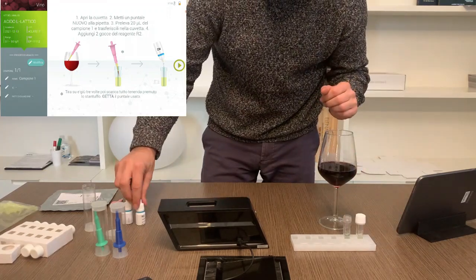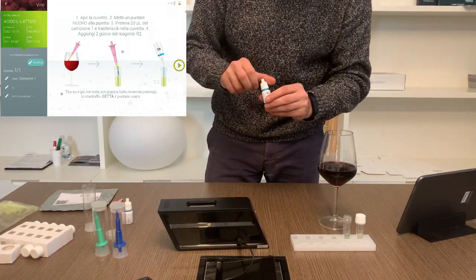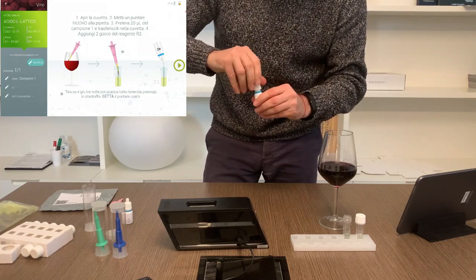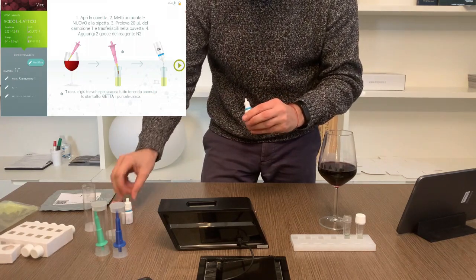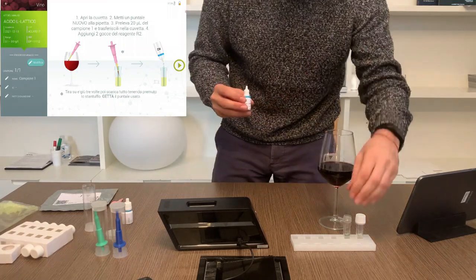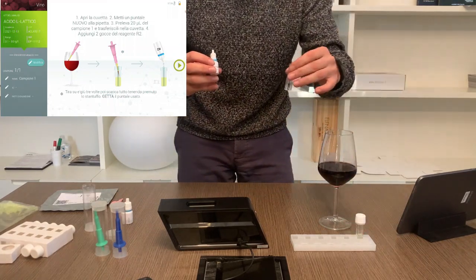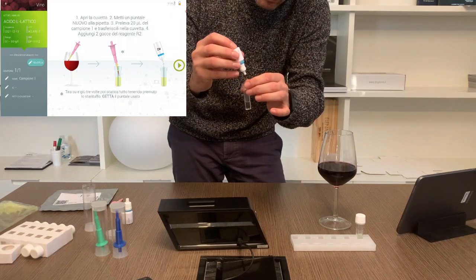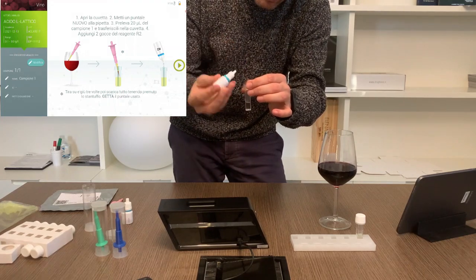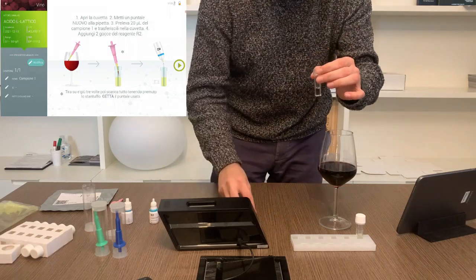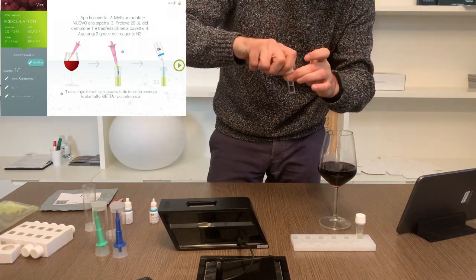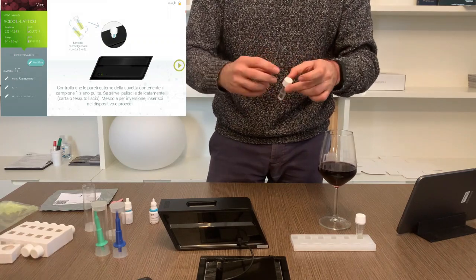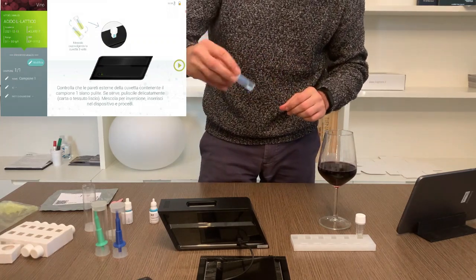For this analysis the app asks you to add two drops of R2 reagent. Take the dropper, turn it upside down so that it is perfectly vertical and with gentle pressure drip the number of drops required by the app. Continue with the screens, mix by inversion and insert the sample into the instrument with the smooth side facing the Smart Analysis logo on the inclined wall.